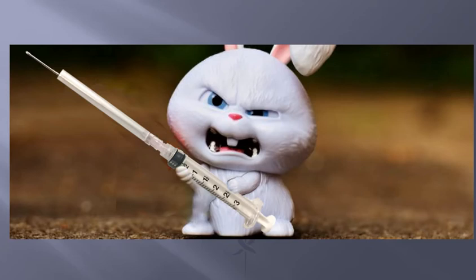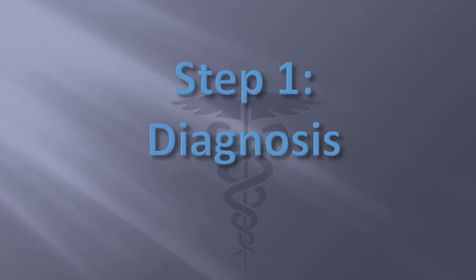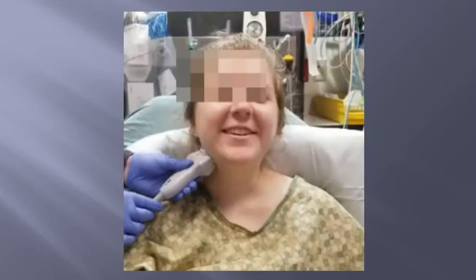So with the approach described by the folks at Massachusetts General, there were basically 3 steps to it. The first step was just making a diagnosis. Is this cellulitis or is it an abscess? And this is basically how you do it. You take a curvilinear probe. You probably could use a linear probe too, but I think you get a nice wide field of vision with the curvilinear probe, and you put it in the submandibular triangle on the affected side, and you just imagine fanning the beam up through the patient's tonsil.